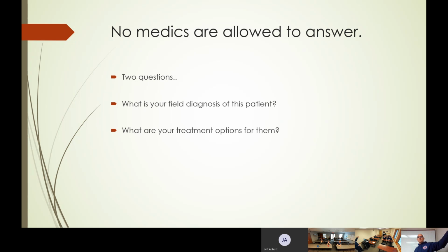It's a really bad situation in the back of Princess Lakes or out in Brown County or wherever the heck you were. So this is really, really good stuff that they're able to give some interventions like this now while they wait for ALS assistance. So what can we do now? Clearly, because that's why we're here. What do we have as an option now? Well, CPAP. Yeah, CPAP. If it's just a moving air issue, that liquid sound, and they're not breathing well, we can assist their ventilations and their breathing with the CPAP.